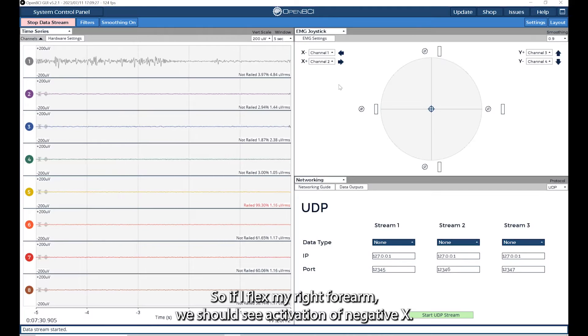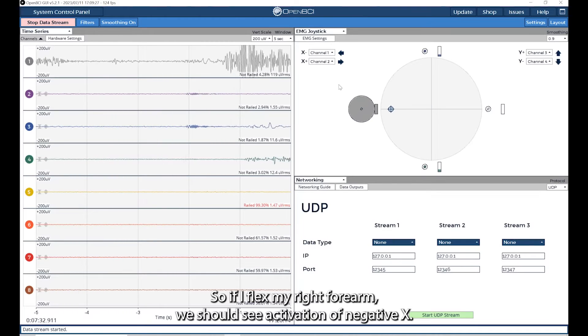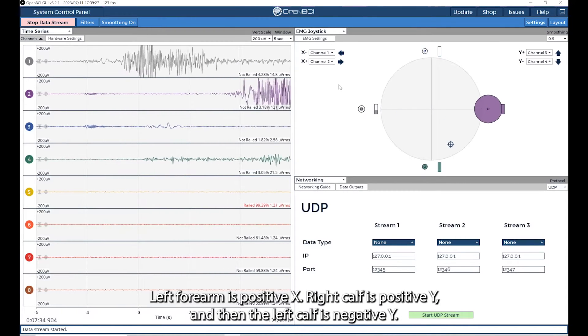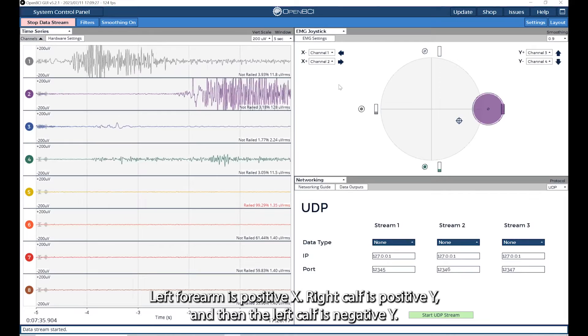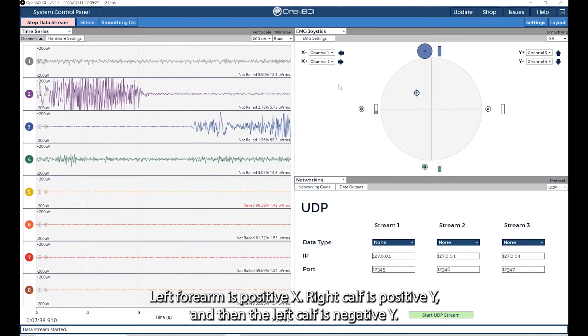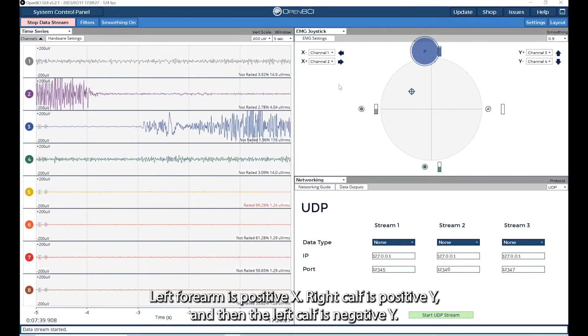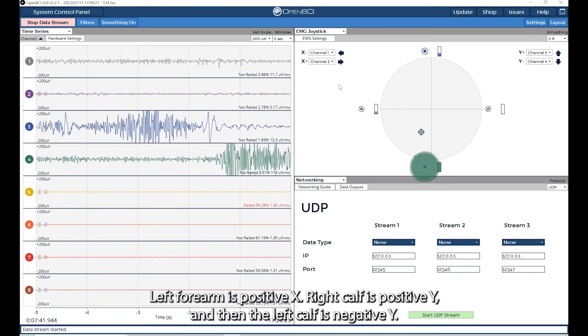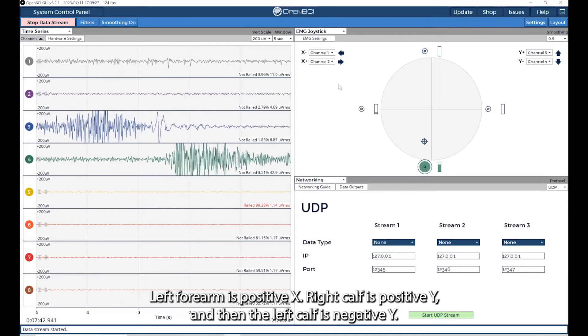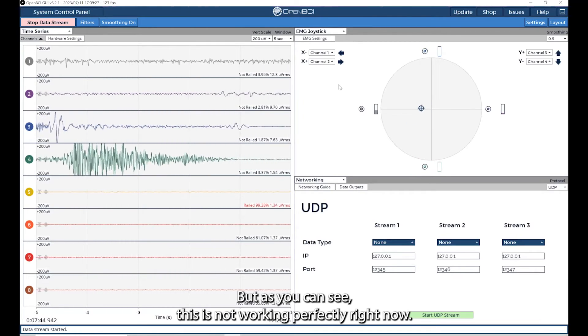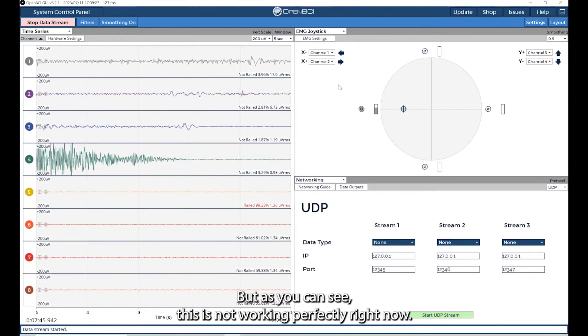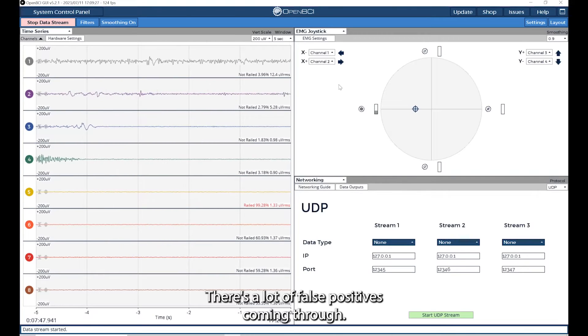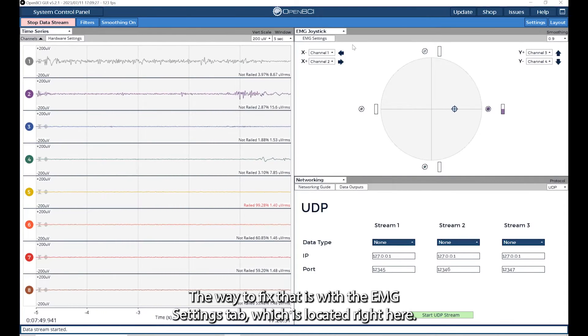If I flex my right forearm, we should see activation negative x, left forearm is positive x, right calf is positive y, and then left calf is negative y. But as you can see, this is not working perfectly right now. There's a lot of false positives coming through. The way to fix that is with the EMG settings tab, which is located right here.